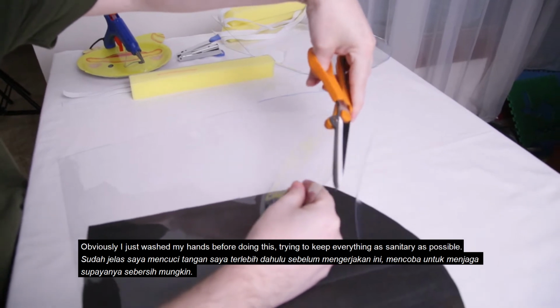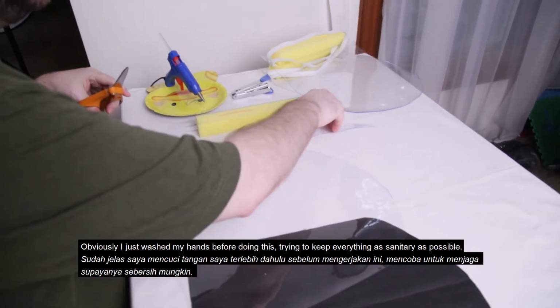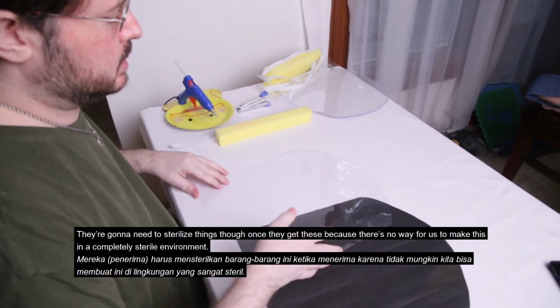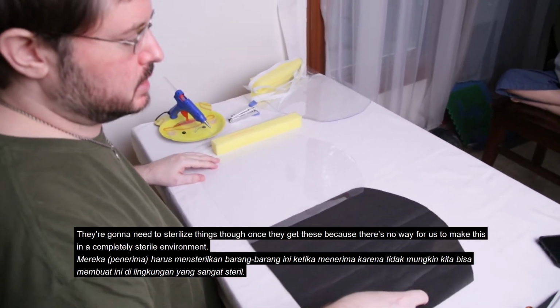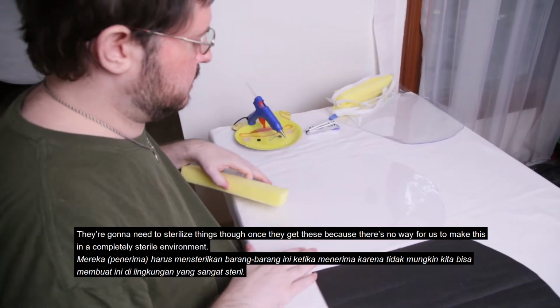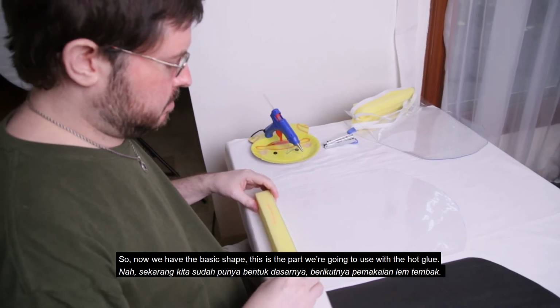Obviously, I just washed my hands before doing this, trying to keep everything as sanitary as possible. They're going to need to sterilize things though once they get these, because there's no way for us to make these in a completely sterile environment. So now we have the basic shape.